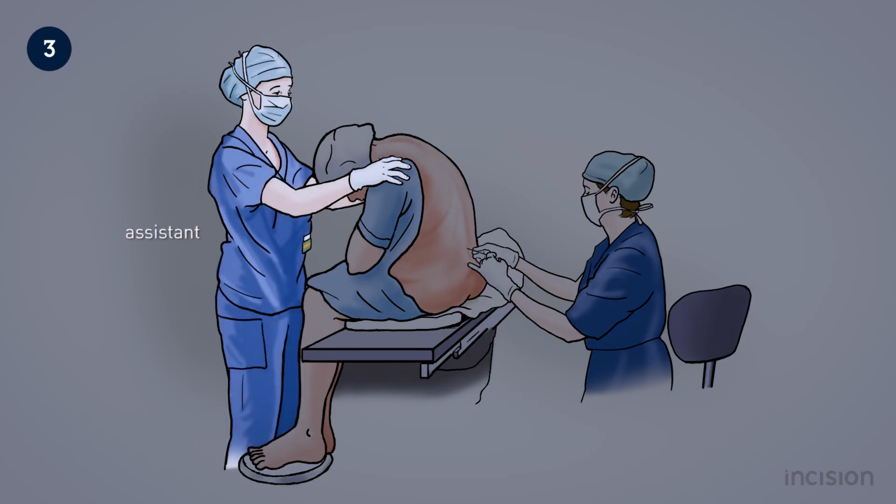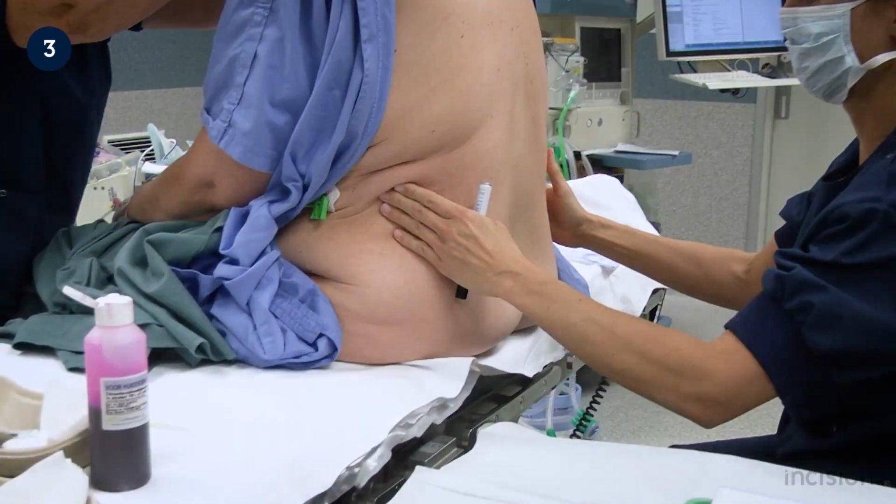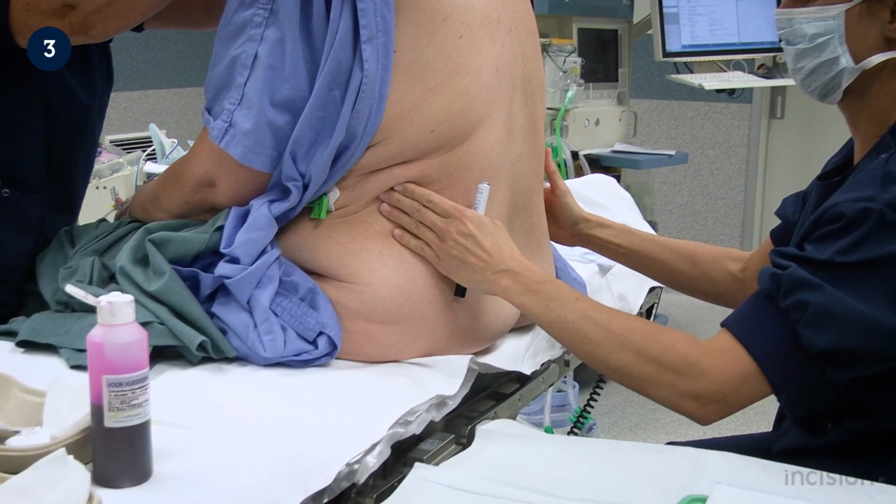And finally, an assistant to reassure the patient during the procedure. This assistant should not attempt to forcibly maneuver the patient into the required position. Because the procedure is performed at the patient's back, they are unaware of the movements of the anaesthetist. The assistant should therefore preempt and communicate the anaesthetist's movements to the patient. Complications can easily occur if the patient is startled and moves suddenly. With optimal positioning obtained, the injection site is now prepared.